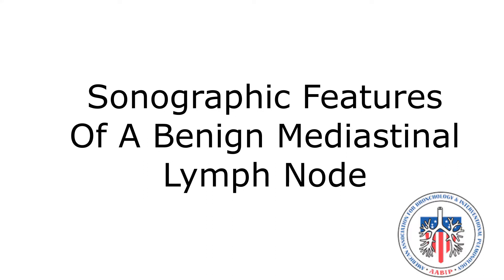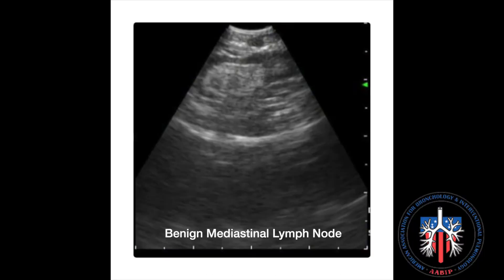Sonographic features of a benign mediastinal lymph node. This is an ultrasound image of a benign lymph node using a linear EBUS bronchoscope.